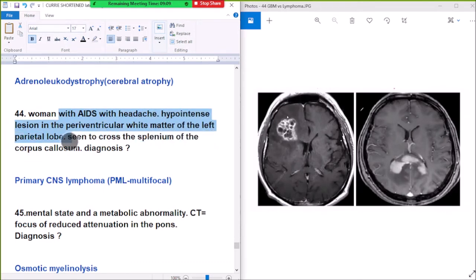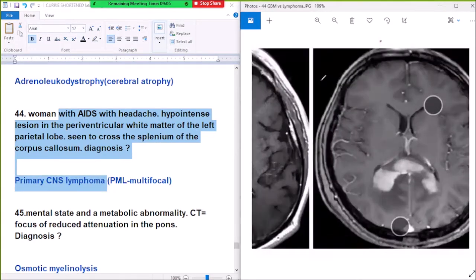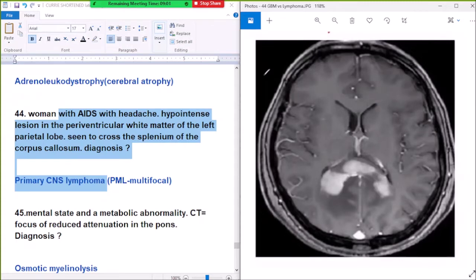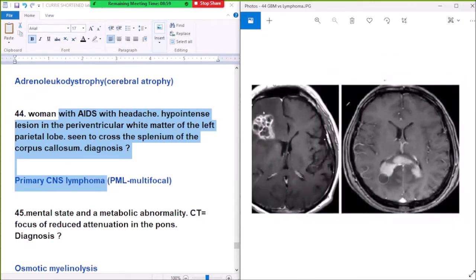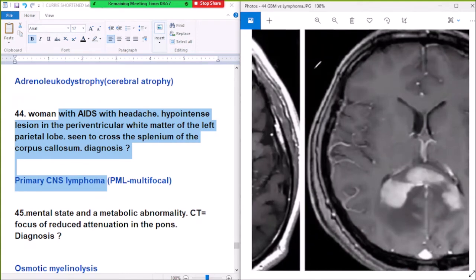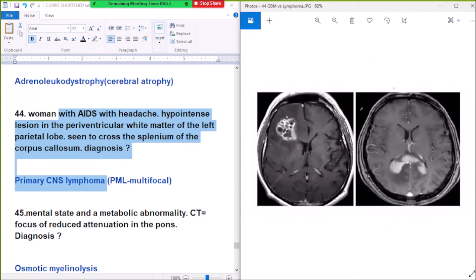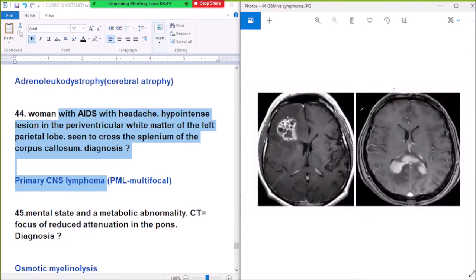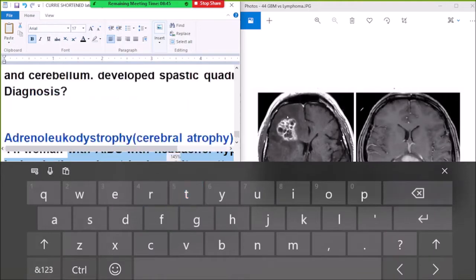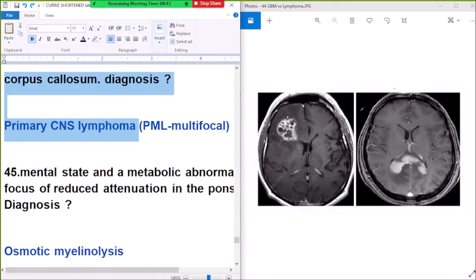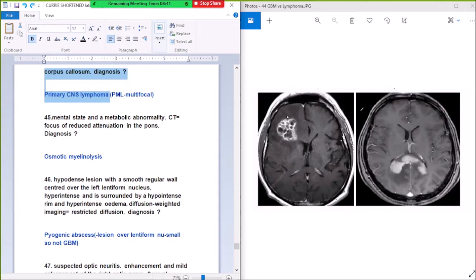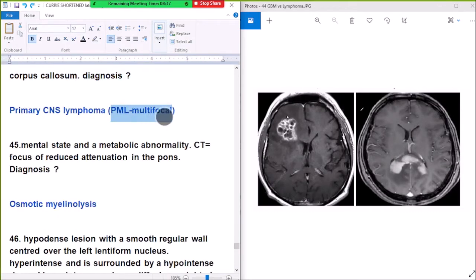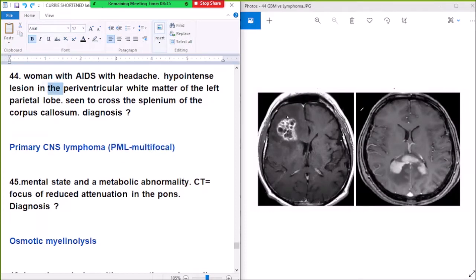Question number 44: a woman with AIDS and headache. There is a hyperintense lesion in the periventricular white matter of the left parietal lobe seen to cross the splenium of the corpus callosum. Diagnosis: primary CNS lymphoma. Another option is PML, but PML is multifocal.